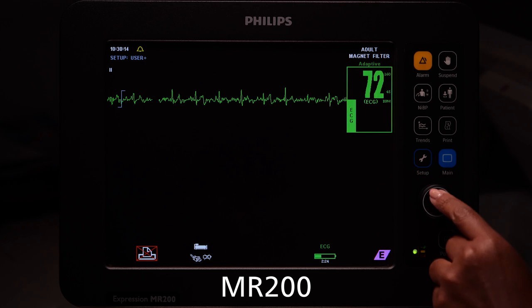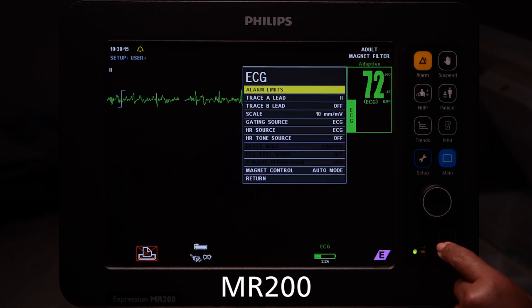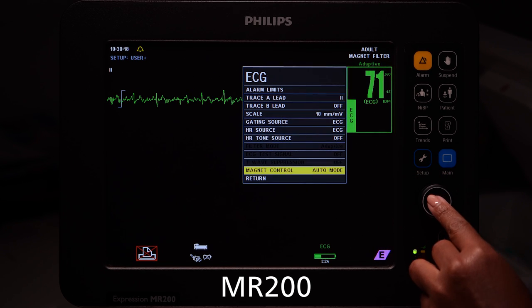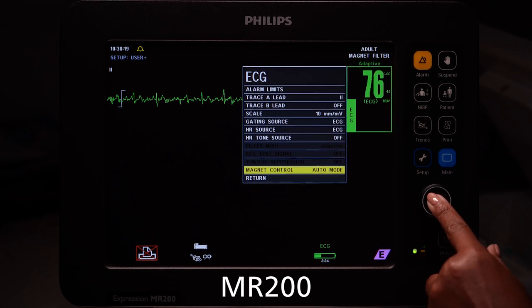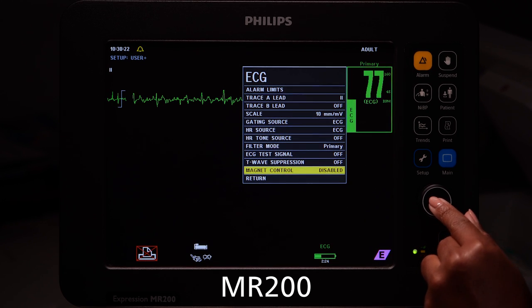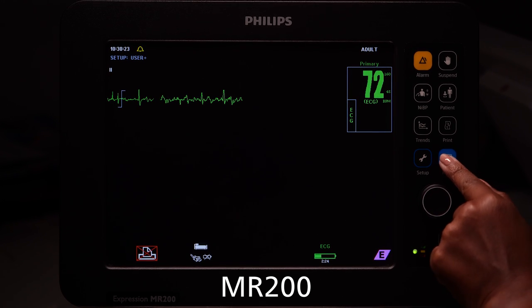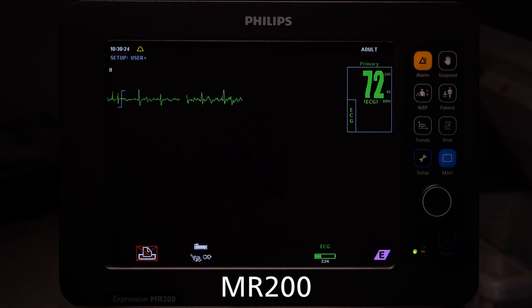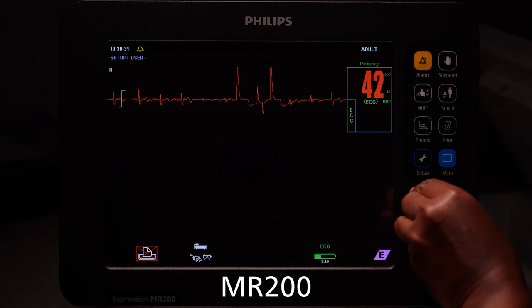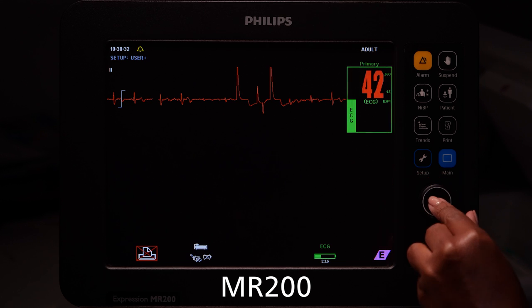To disable Magnet Control on the MR200, scroll and select the ECG menu, then scroll and select Magnet Control, and set Magnet Control to Disabled. With Magnet Control Disabled, you can scroll through the monitor's ECG filters to determine which filter provides the best ECG signal.